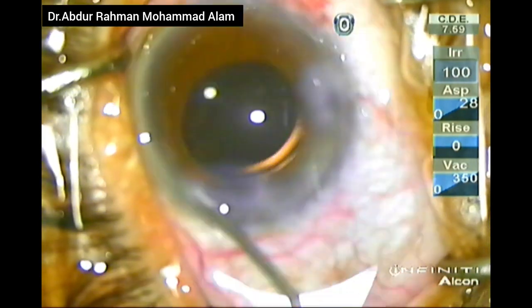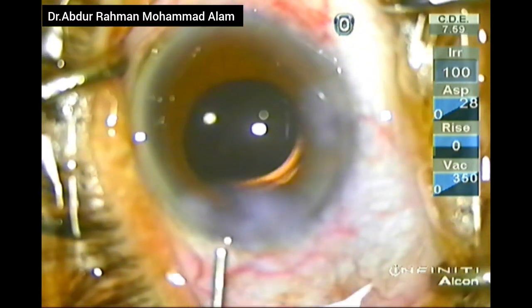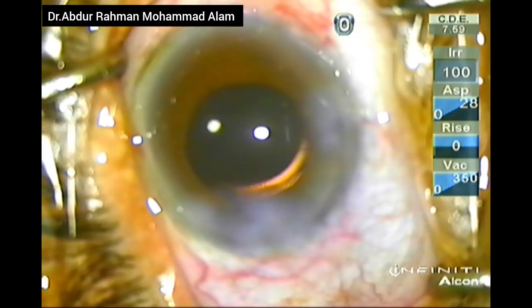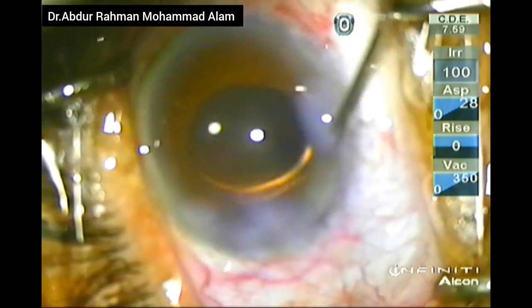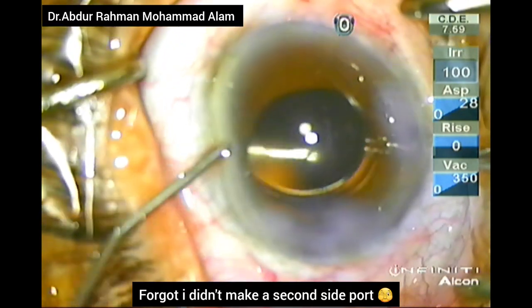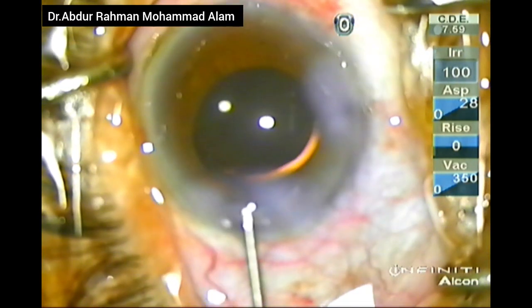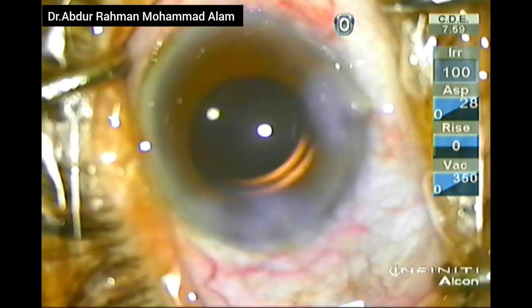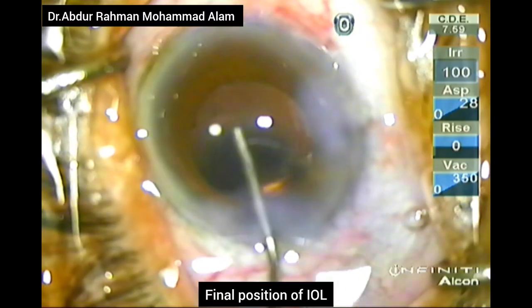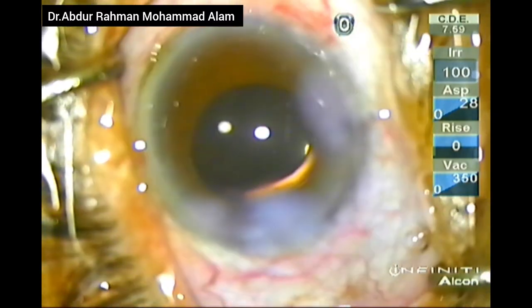I will perform stromal hydration of the wound and give subconjunctival injection and the case is completed. You can go back and pause the video to see my settings at various stages of the surgery.